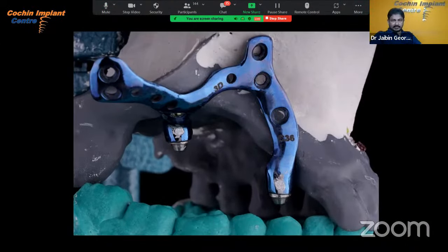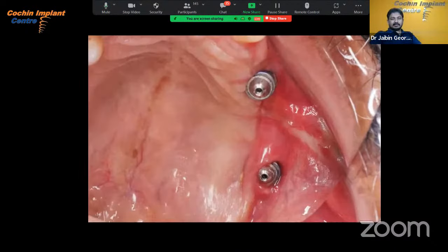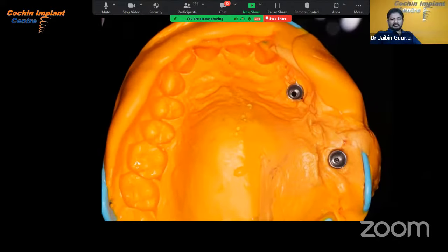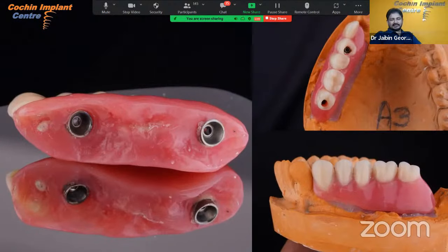This is the implant. And this is after surgery. Again, multi unit healing abutments. This is the implant. Impressions. This is the prosthesis which was loaded again on the third day after surgery.